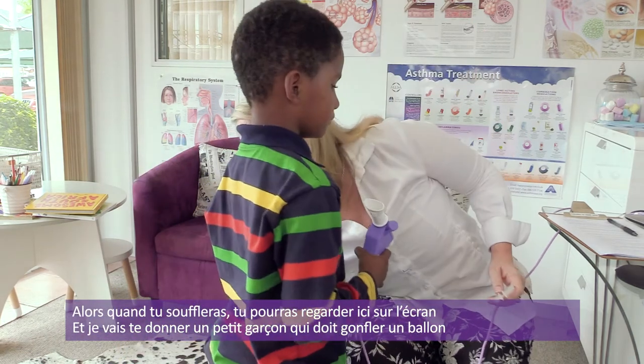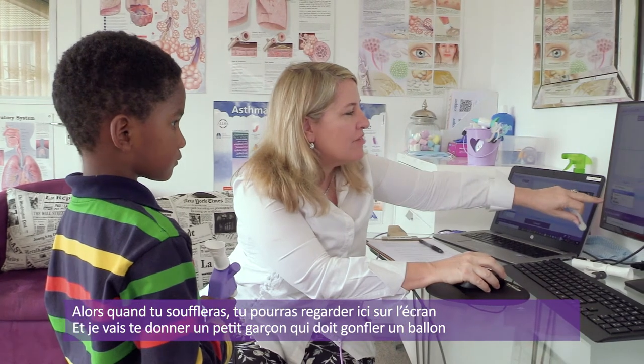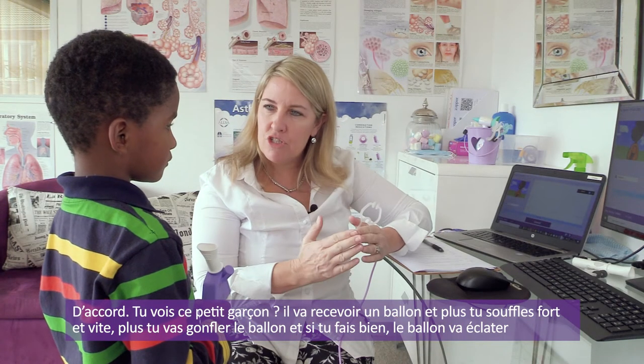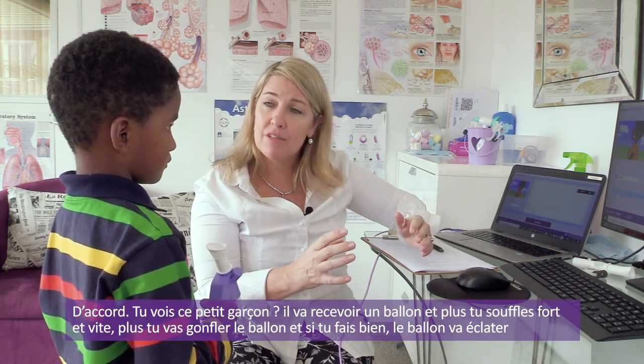All right, so when you blow, what you're going to do is watch here on the screen, and I'm going to give you a little boy with a balloon to blow out, okay? So, you see that little boy? He's going to get a balloon, and the harder and the faster you blow, the more the balloon will blow up, and if you get it right, it'll eventually burst. Okay, the balloon.